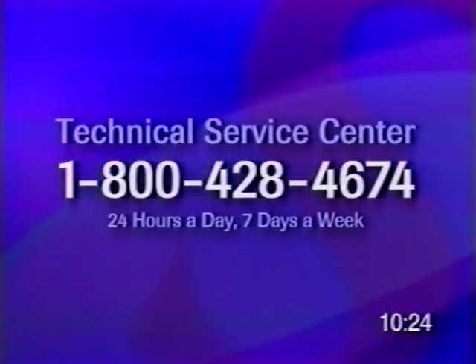Again, if the result is outside of the range listed on the EQC device for either the Level 1 or Level 2 EQC, run another test. If the repeated test is outside the designated range, then you should call the Roche Diagnostics Technical Service Center.